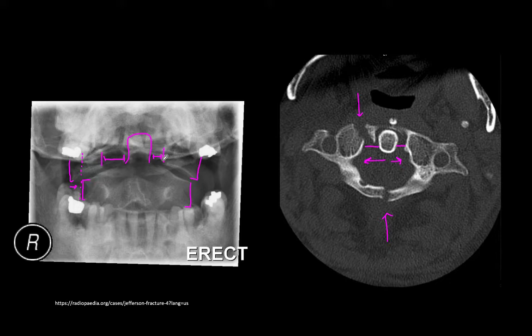And then collectively, in the face of fracture, they should not exceed 8 millimeters combined. If we look at this space, periodontoid space 1, and add it to periodontoid space 2, anything in excess of 8 millimeters is suggestive of transverse ligament rupture. And remember, the transverse ligament kind of attaches in this perspective. So very often when atlas breaks, the transverse ligament can be torn. And that's something to look for.